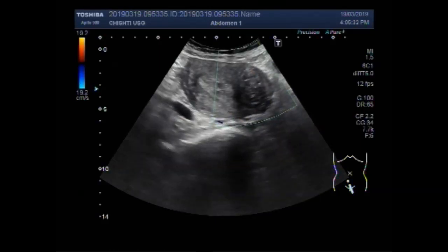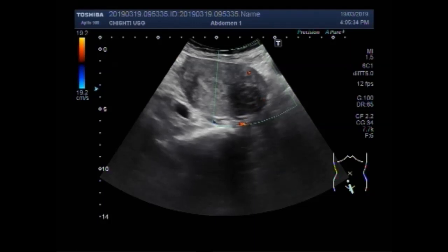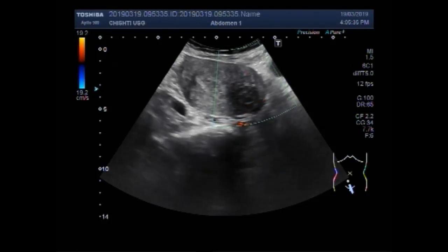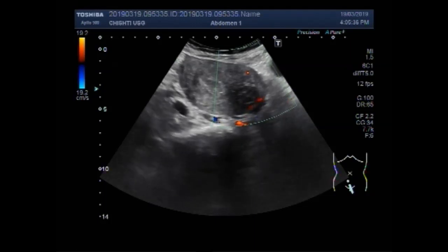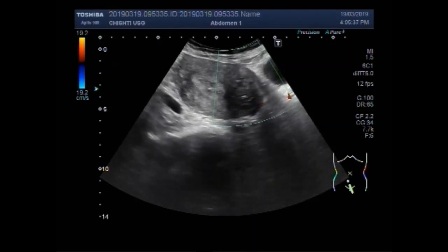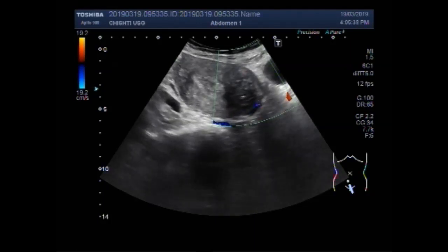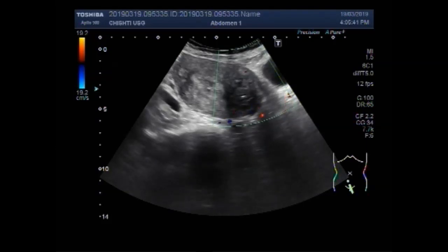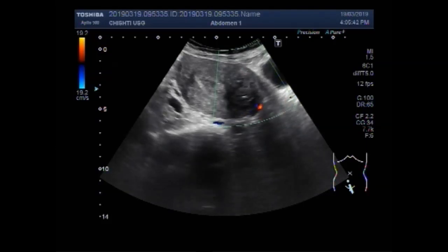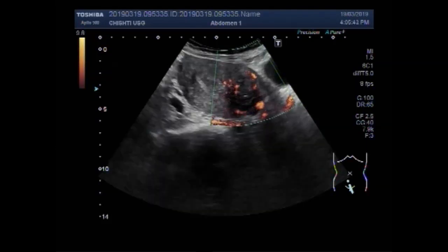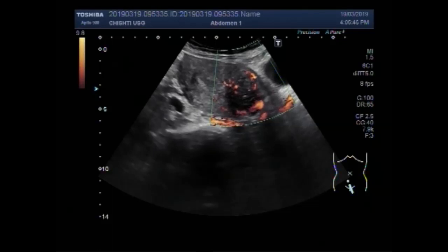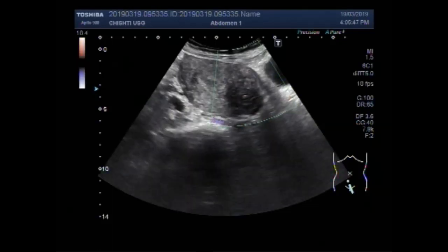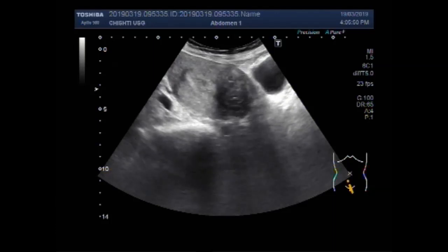Now you can see blood flow inside the fibroid. Blood flow is seen in the rim of the mass in the peripheral region.